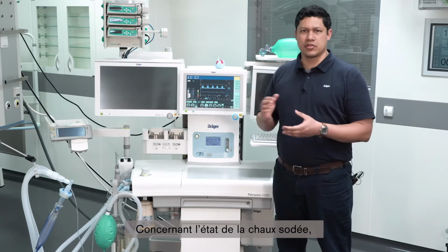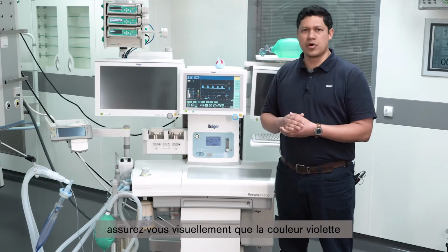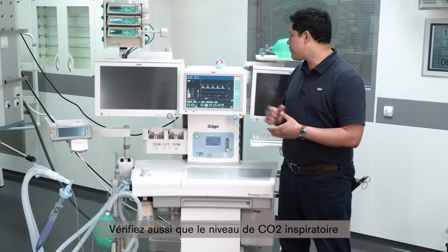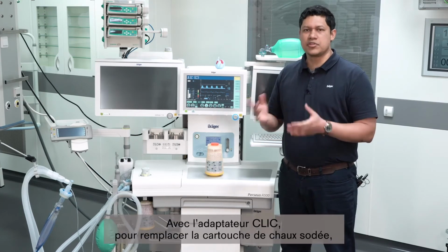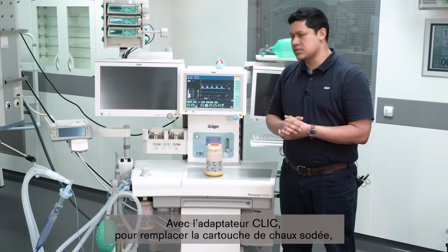To verify on the condition of the soda lime, you will have to visually inspect that no more than 2/3 of its content has turned into color purple. Additionally, you will have to verify that the inspired level of CO2 is not higher than 5 millimeters of mercury.